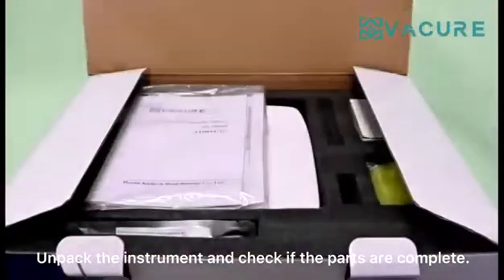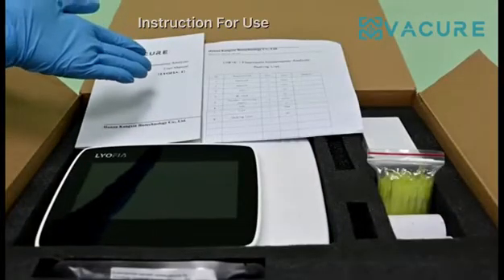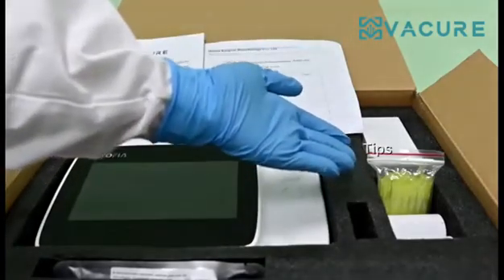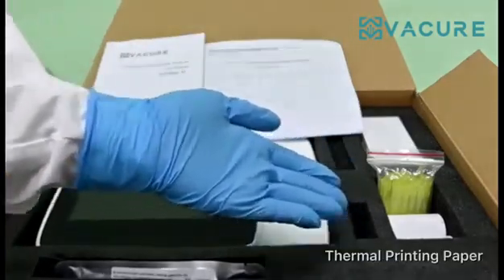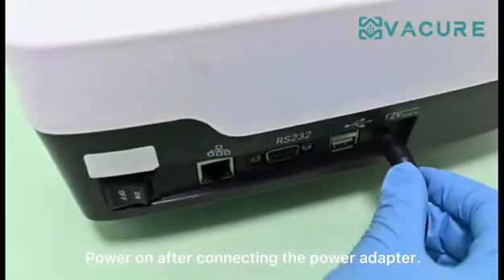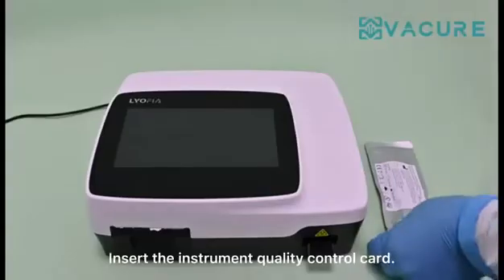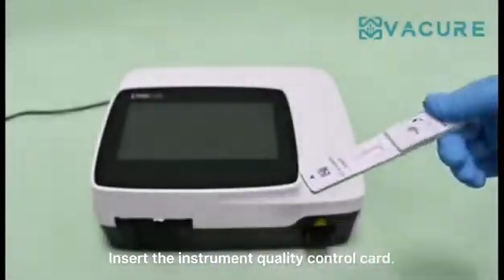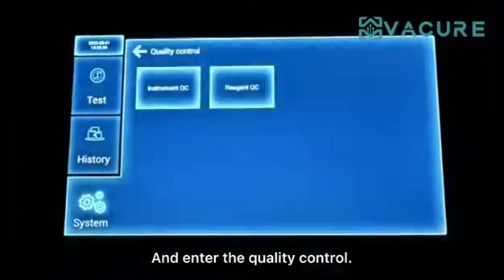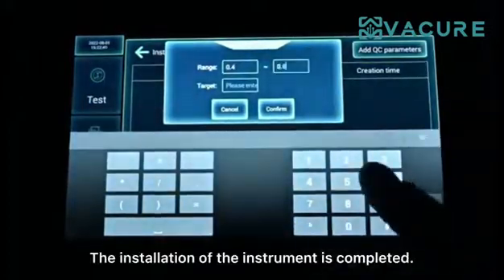Unpack the instrument and check if the parts are complete. Power on after connecting the power adapter. Insert the instrument quality control card and enter the quality control. The installation of the instrument is completed.